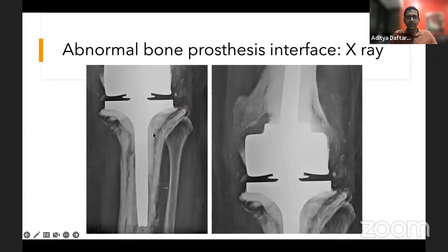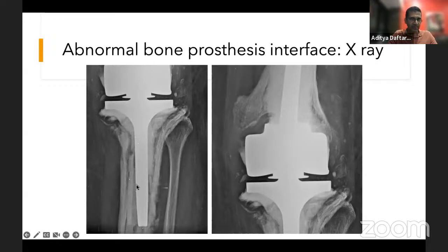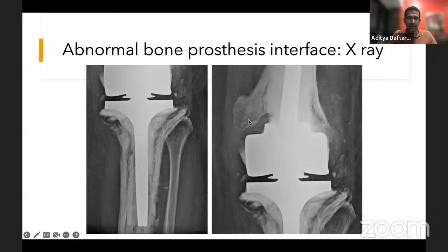Here's abnormal bone prosthesis interface on X-ray. Along the cement under the tibial tray, there's lucency — possibly osteolysis or membrane formation. Along the cement-prosthesis interface, there's a lucency narrower superiorly and wider inferiorly, with lateral displacement — abnormal. On the femoral side of the same patient, there's a large area of scalloped bone — osteolysis. So one represents membrane formation or poor osteointegration, the other is osteolysis.